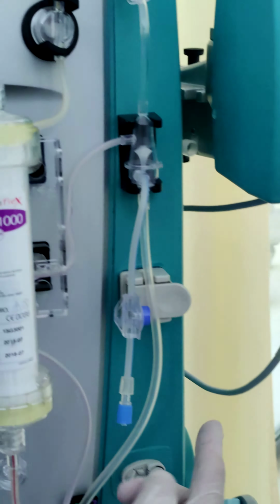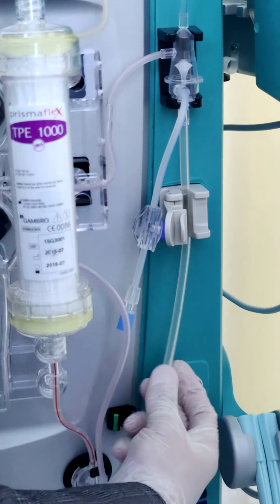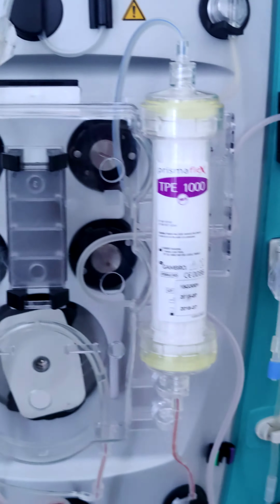Two things also. One, two. Which one? This is the air detector, and the return clamp. And close. Easy?